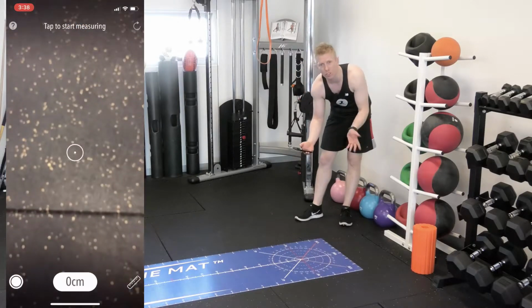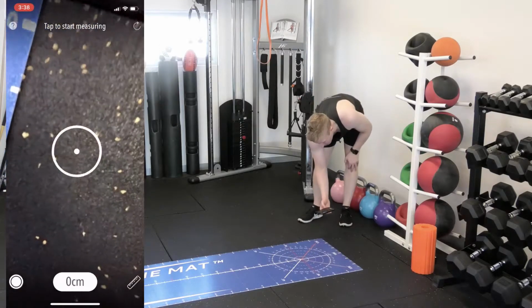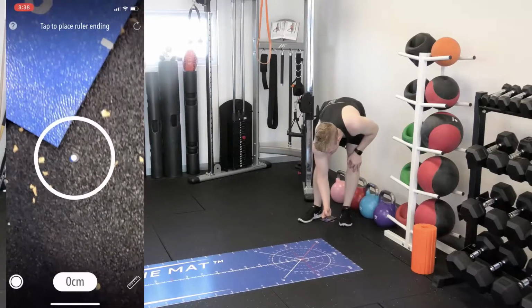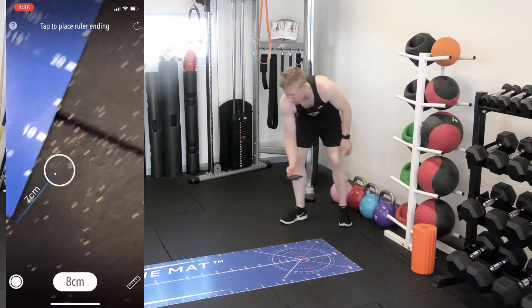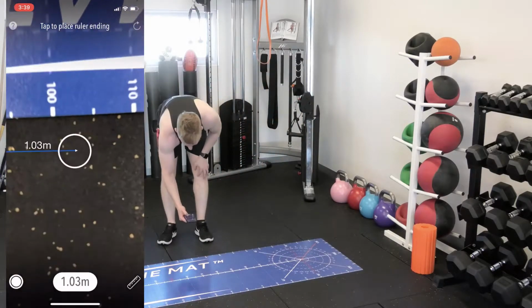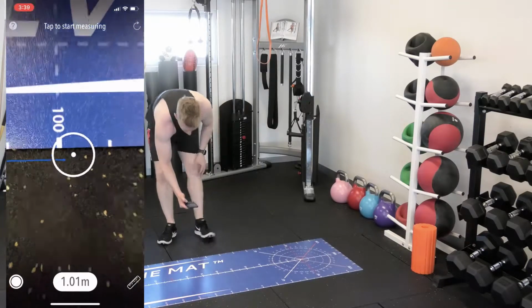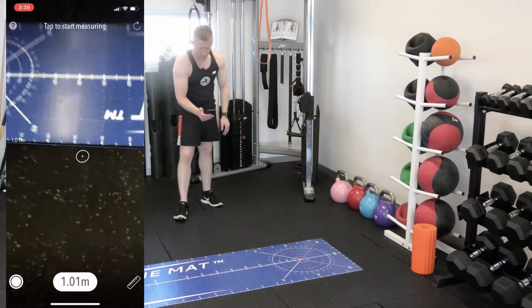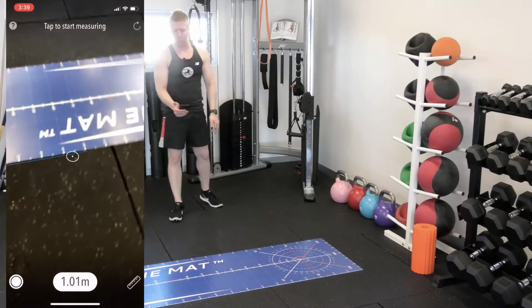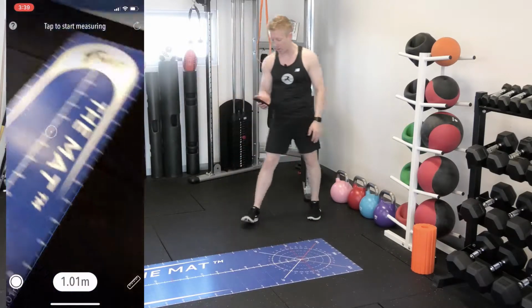So it takes a little while to identify the world around, but what we're going to do is we're going to show the mat, which we know is a really highly accurate tool, and I'm going to set a start point right on the edge of the mat. And what I'm going to do is I'm going to take this and I'm going to start to place that up against that 1 metre line. And what you'll see, oh, I've put a little bit off there, but that measurement stays there. And as you can see, it's pretty much spot on 1 metre, exactly the same as the mat, which we know is a highly accurate tool.